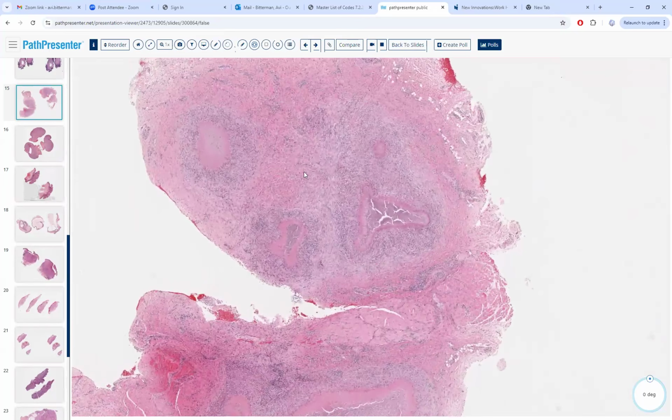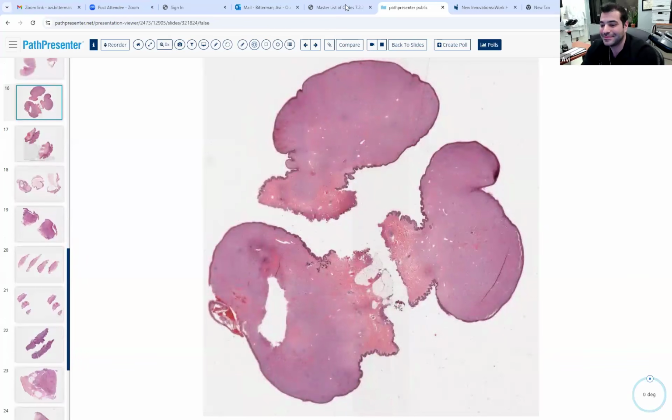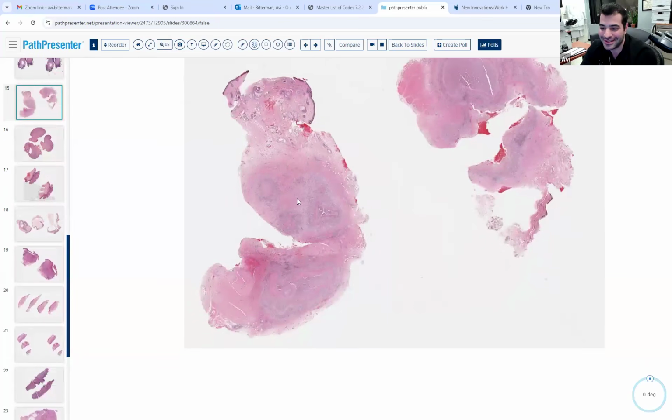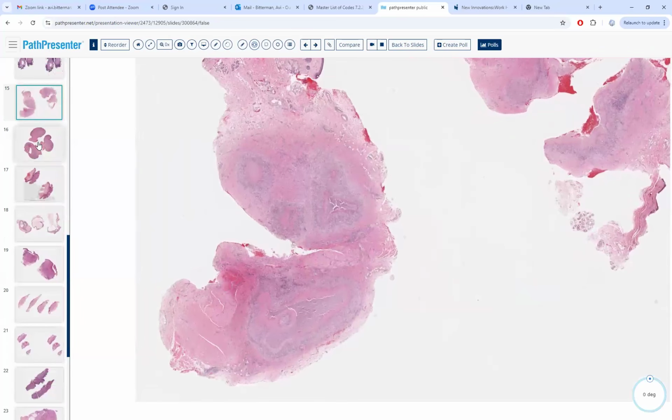What type? Miliary TB. And what are you going to do? Stain it with the same things we talked about. Very good. So the answer was lupus miliaris disseminatus faciei, LMDF.